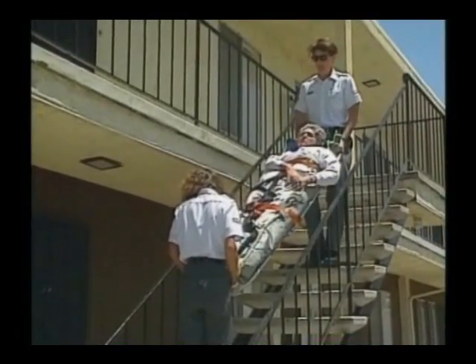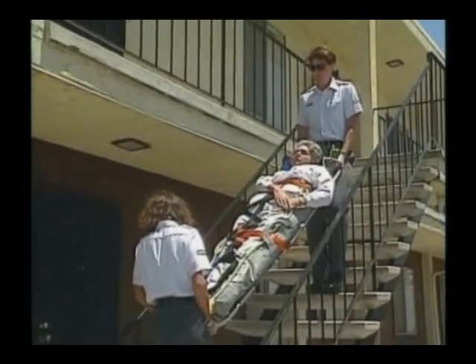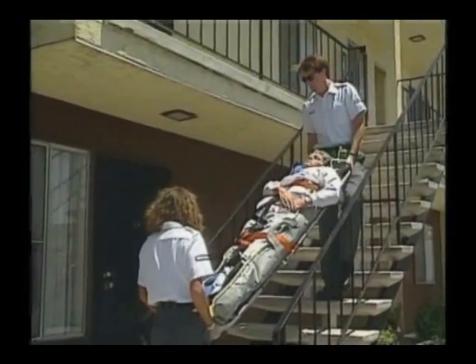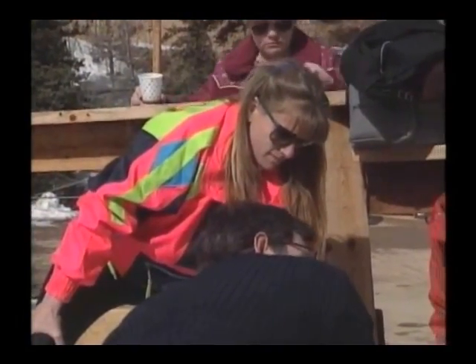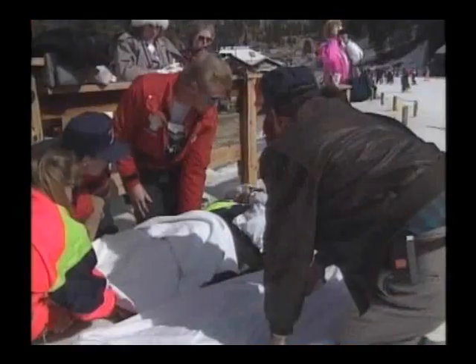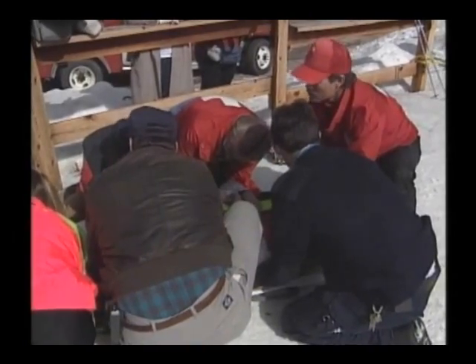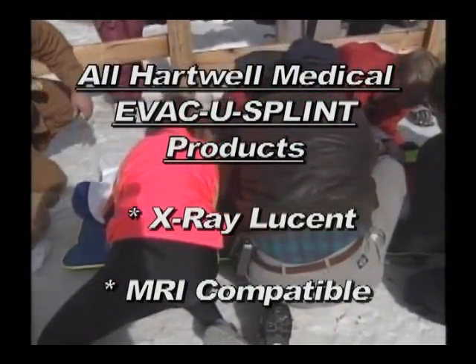When faced with a situation that requires lifting end-to-end — that is, going up or down stairs — use a long spine board or a scoop-type stretcher or flat stretcher underneath the vacuum mattress. Vertical rescue requires the use of a basket stretcher or a similar device. When using any accessory stretcher, always make sure the vacuum mattress is secured to the stretcher prior to moving the patient. A sturdy draw sheet can be used to make patient removal at the hospital easier. Always check the rigidity of the mattress before lifting the patient off the ambulance cot or other patient handling devices. The Evacuosplint mattress is X-ray lucent and MRI compatible.